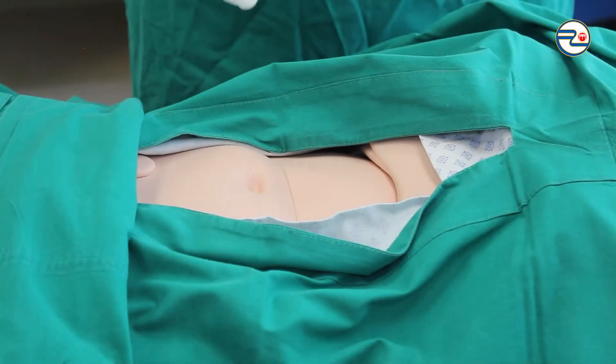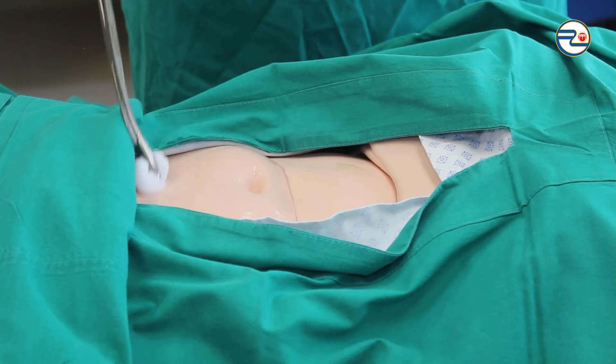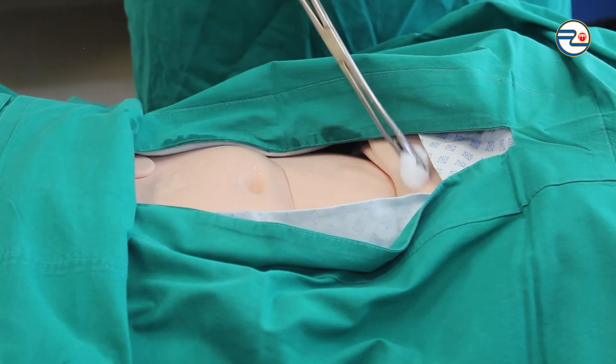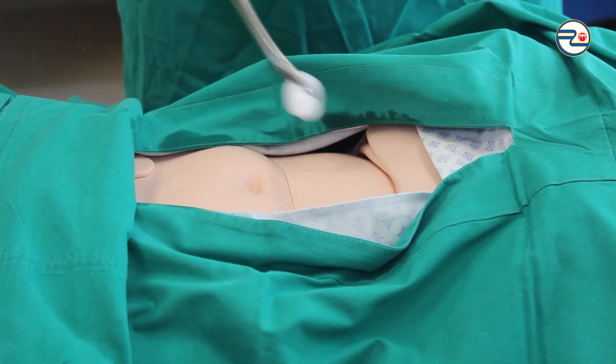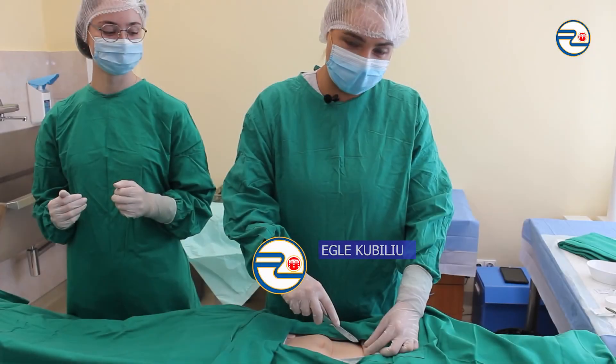Lastly, I'm preparing the open surgical site with antiseptic from the center to the periphery one more time before the incision. And also, I'm waiting until the surgical site becomes dry.